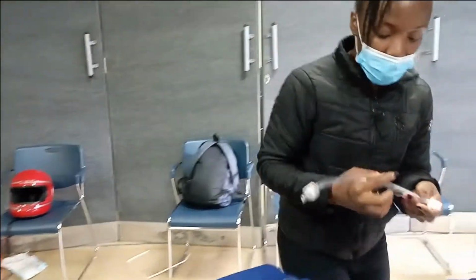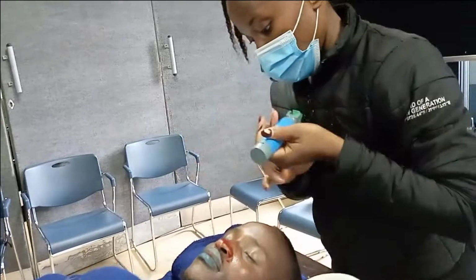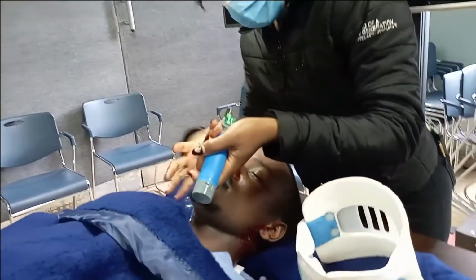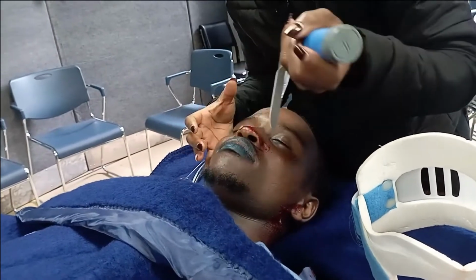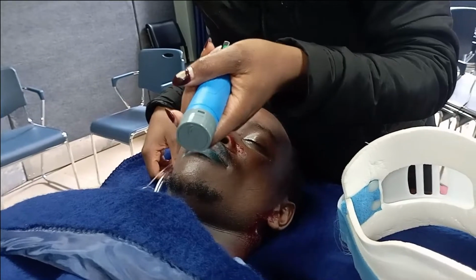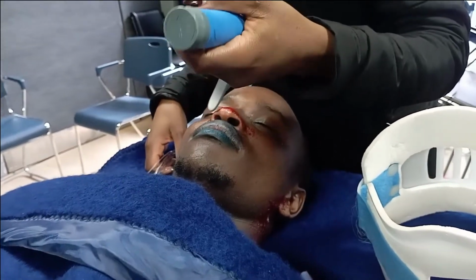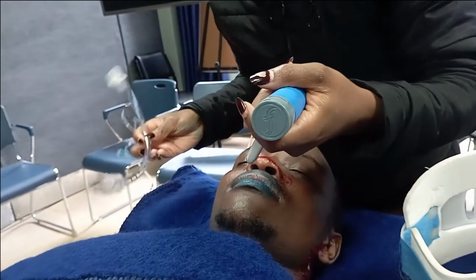Okay. So size 7, give me a laryngoscope. Laryngoscope given to you. So we open the mouth. We sweep the tongue to the left. And then we visualize the epiglottis. Then we lift the laryngoscope a bit higher. We visualize the vocal cords.